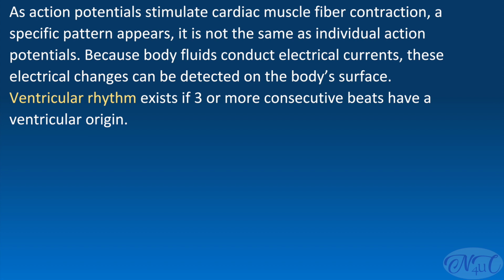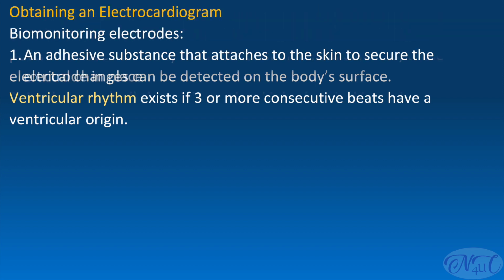Action potentials stimulate cardiac muscle fiber contraction. A specific pattern appears. It is not the same as individual action potentials because body fluids conduct electrical currents. These electrical changes can be detected on the body surfaces. Ventricular rhythm exists if 3 or more consecutive beats have a ventricular origin.